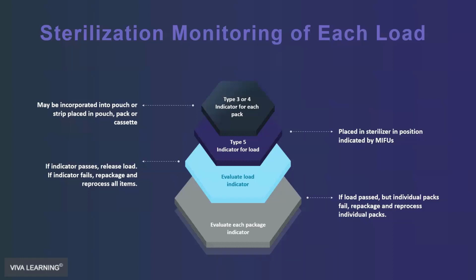But I cannot tell you how many times I hear from practices that will say, oh my gosh, as we were cleaning up the room, we realized that there was no color change on that pouch of instruments we just used on the patient. And panic will set in, trust me. So we check them, every pouch, every package, pouches as we take them out of the load. Now, you are not going to unwrap the cassettes when they come out of the load. You do that right before you're going to use those instruments on the patient in the treatment room.